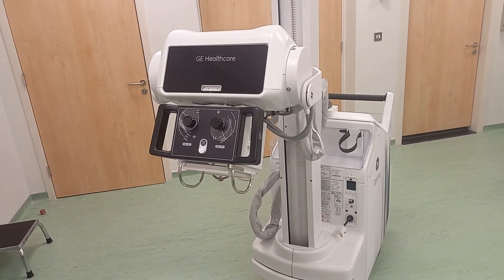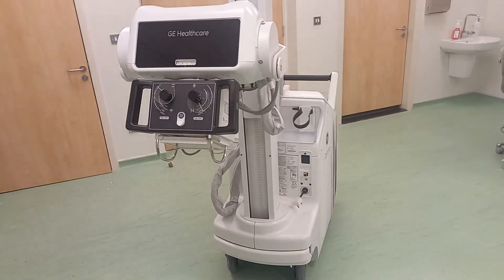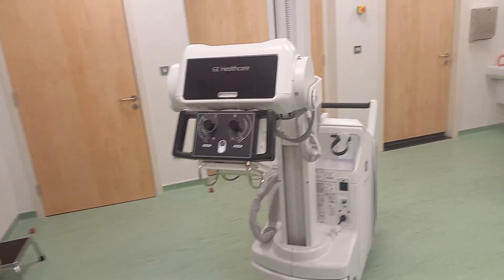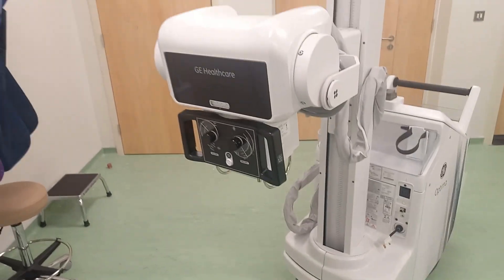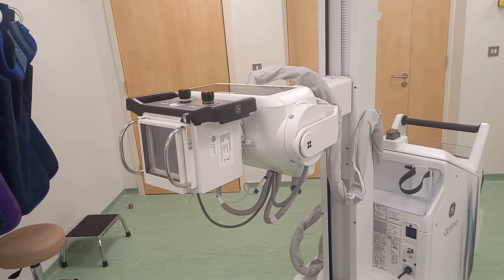With the portable x-ray, the tube can be maneuvered into various positions — like that, and that's another position.